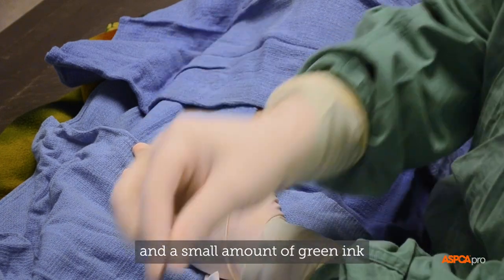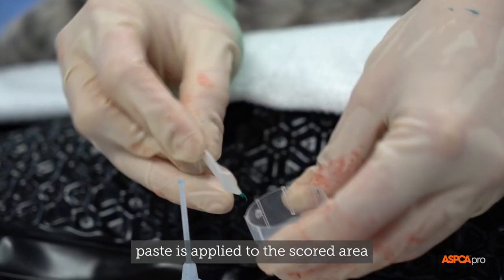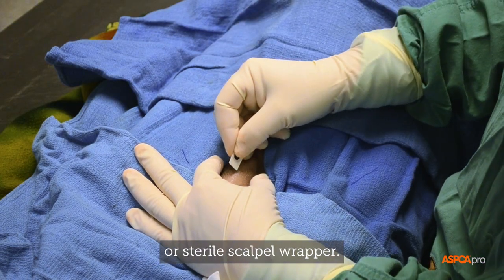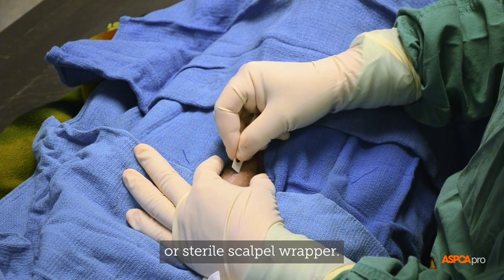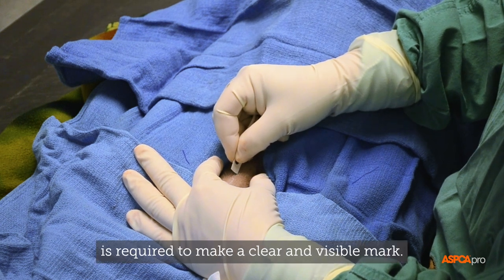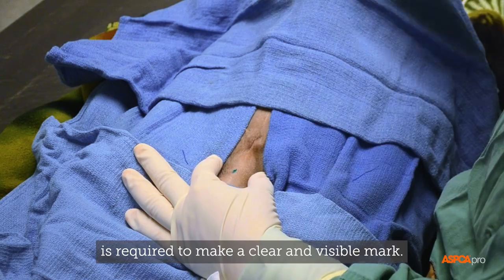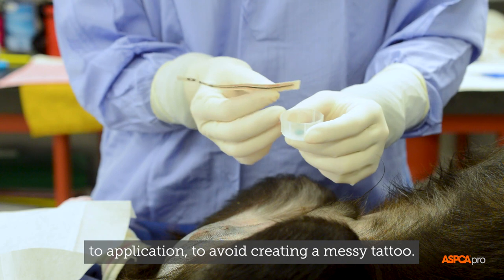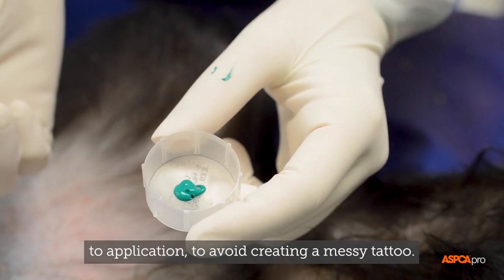The score is placed into the dermis and a small amount of green ink paste is applied to the scored area with a sterile indicator strip or sterile scalpel wrapper. A very minimal amount of ink is required to make a clear, visible mark. Any excess ink can be dabbed on your surgical glove prior to application to avoid creating a messy tattoo.